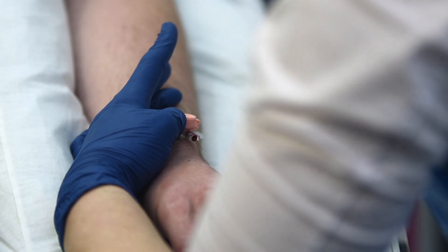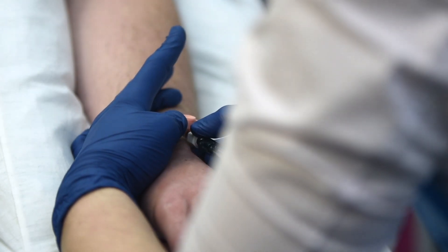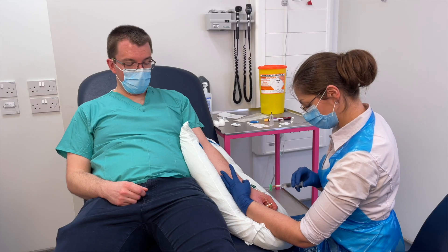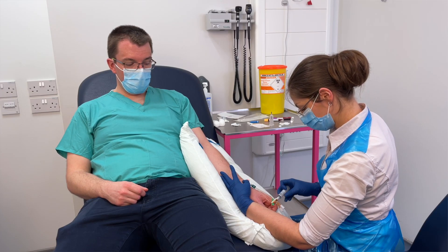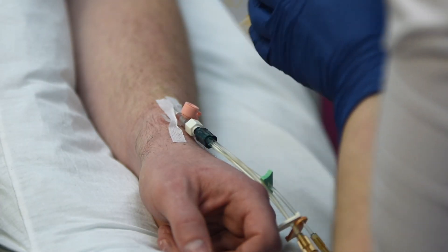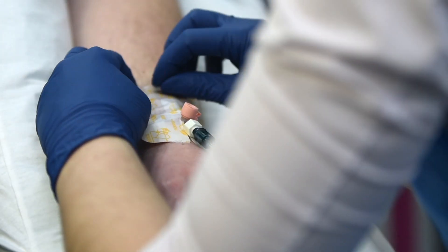Put on your octopus or bionector and flush your cannula. Check the patient's not in any pain - they may feel a cold sensation up their arm, which is fine. You should also look at where the tip of the cannula is to see if there's any sign of the skin ballooning, which would suggest that the cannula has come out of the vein and is tissued. If you're happy with your cannula placement, dress the cannula and make sure the entire cannula is covered. You need to put a time and date sticker on the cannula so that people know when it went in and can check that it's still okay to be used.